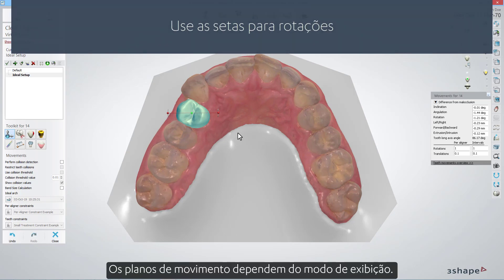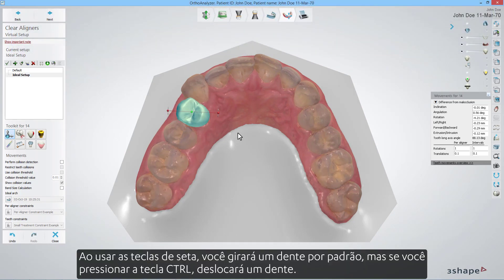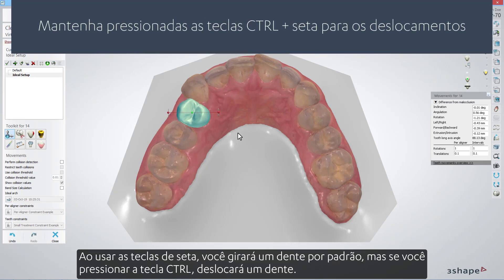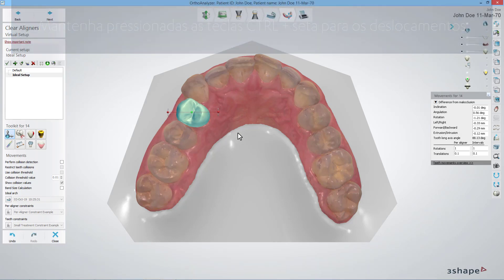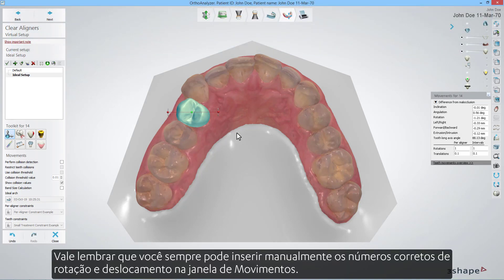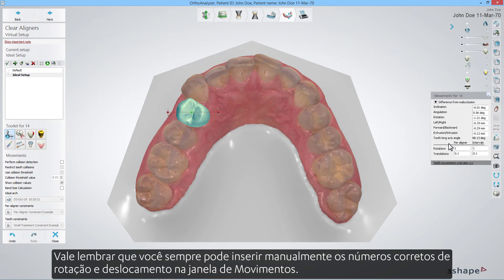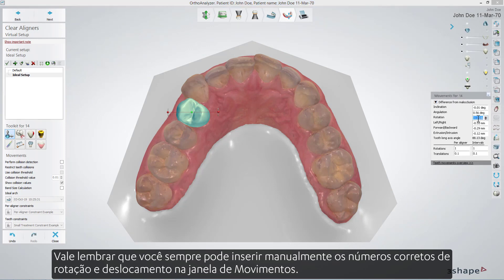The movement planes depend on the view. By using the arrow keys you will rotate a tooth by default, but if you hold down the control key, you will translate a tooth instead. It is worth remembering that you can always manually enter the right rotation and translation numbers in the movements window.